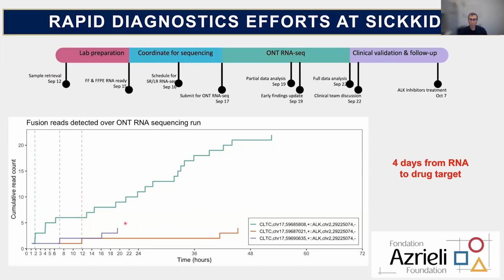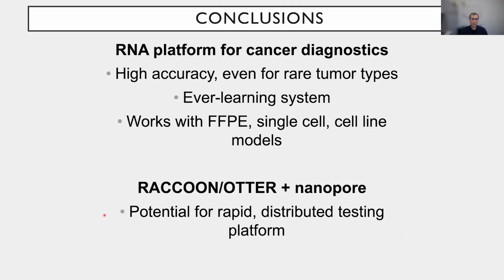We're beginning to become a little bit more organized so that we can do exactly that, as part of an Azrieli Foundation funded partnership with St. Justine Hospital. We began to put all the informatics as well as the protocols in line to be able to do this quicker. And you can see if you retrospectively look at the data that the dominant fusion really appeared after maybe a couple hours and began to be quite clear after 6 hours. So we probably could have reported this out even faster, and that's what we'll be doing for ongoing patients.